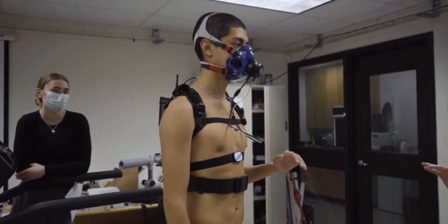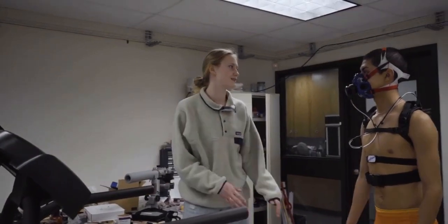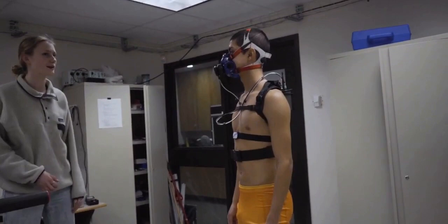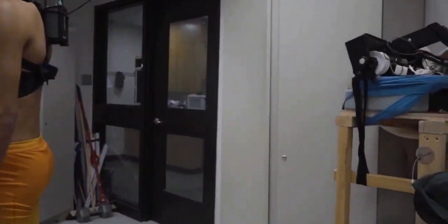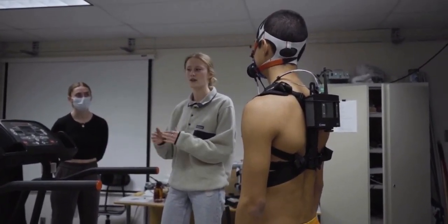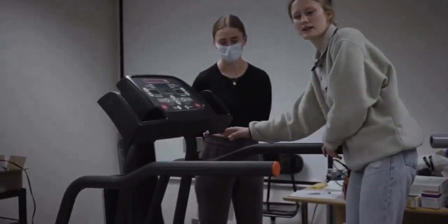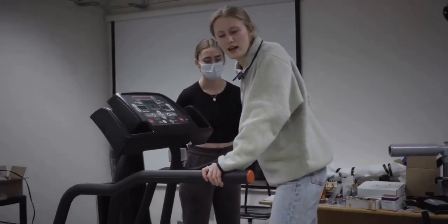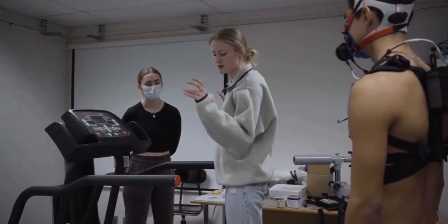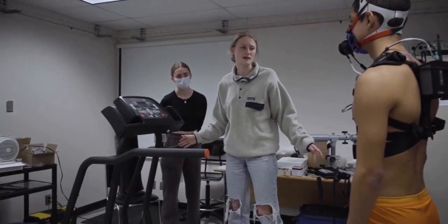The treadmill maxes out at 12 miles an hour, so after that we're just doing incline. We're not gonna tell you when the test ends — it's up to you when you've reached your VO2 max and can't go anymore, or if you're gonna fly off the back. If you choose to end the test midway through a stage, you can hit stop here, stop back here, or jump off. If you find yourself tripping or stumbling, you can grab on or jump off for a second and jump back on. That doesn't have to be the end of your test.